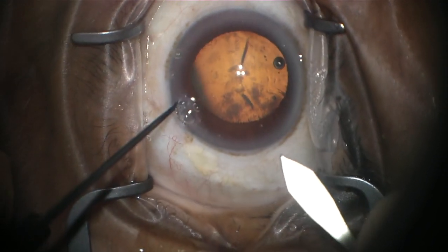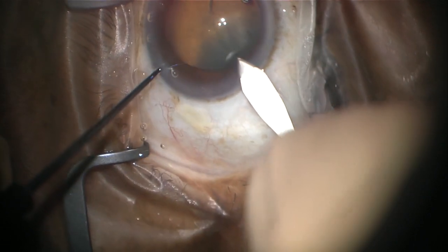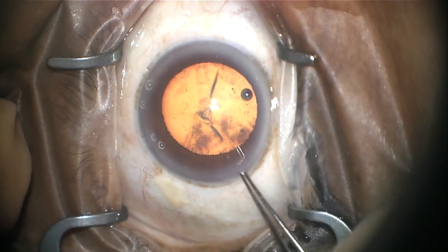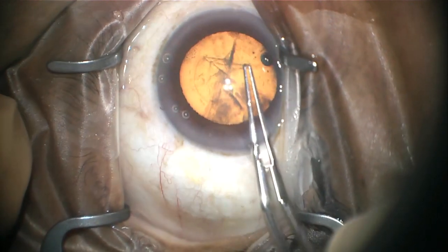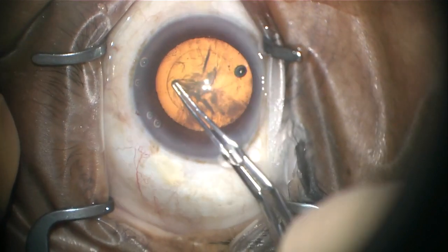A second, slightly larger incision is made in the eye. This is the primary wound — the wound where the cataract is taken out and the new lens is put in. Forceps are then used to create a capsulorhexis, which is an opening in the bag that holds the lens you were born with, which is your cataract.